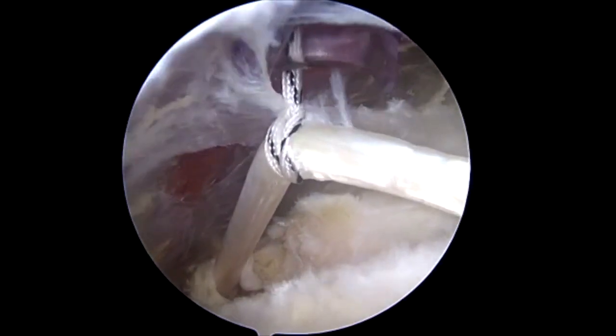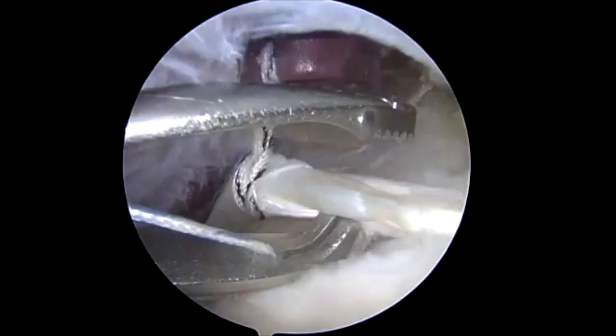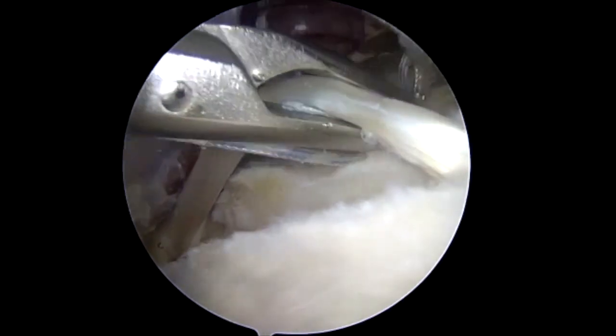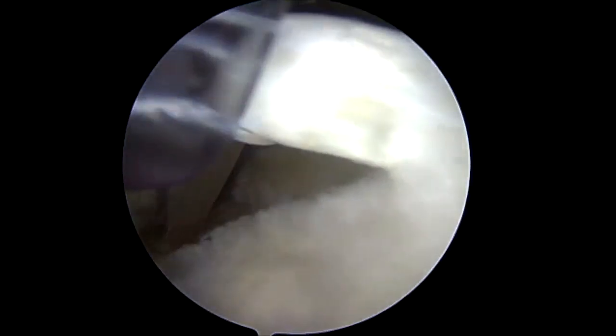In a similar fashion, a second suture tape is looped around the biceps tendon using an antegrade suture passer and cinched. Note that spacing between the sutures can still be adjusted for the next step.